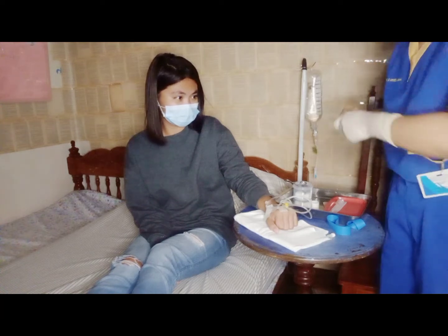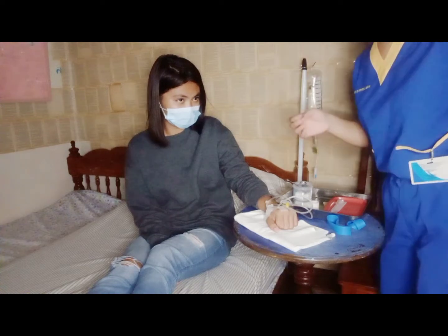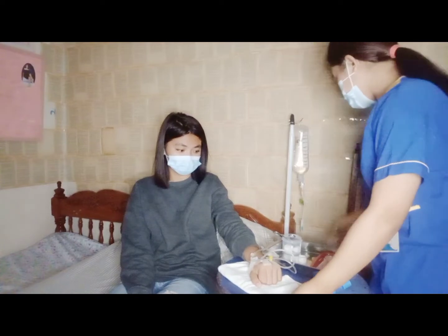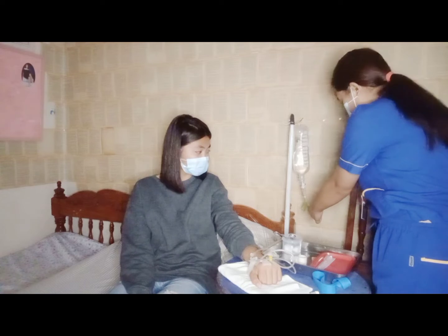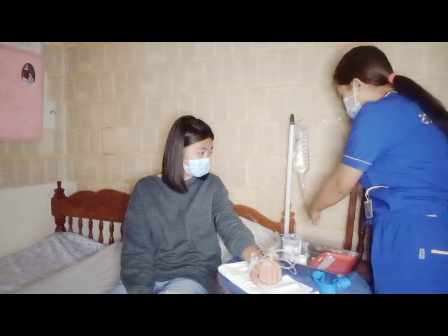So, I will remove my gloves. This is to prevent contamination. Then, discard it. Okay. And then, we will open the clamp and adjust the flow rate of the solution.